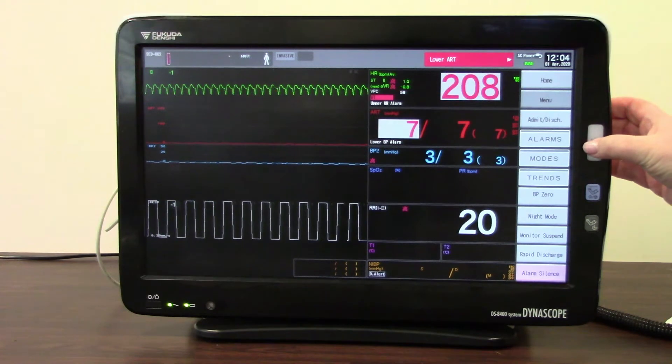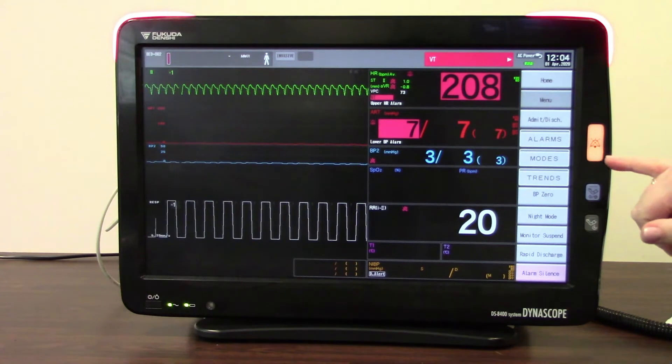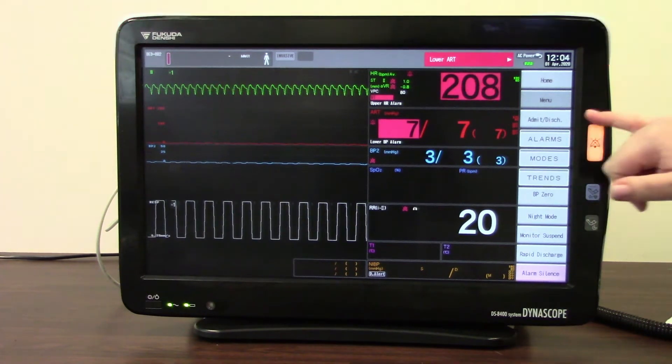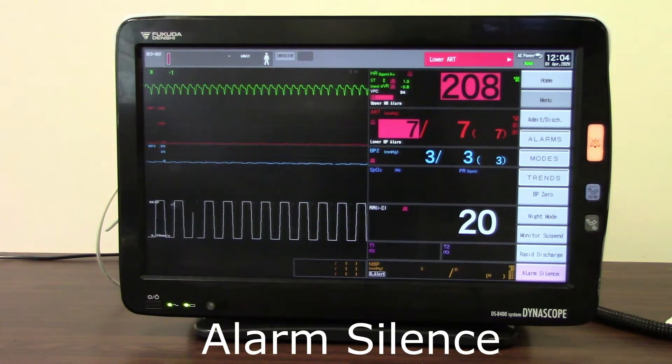I'm now going to activate the alarm silence button. As you can see, it will silence the alarm — the button lights once it's been pressed. It will silence a parameter-specific alarm — in this instance VT — for one or two minutes depending on how it's been set up on your monitor.